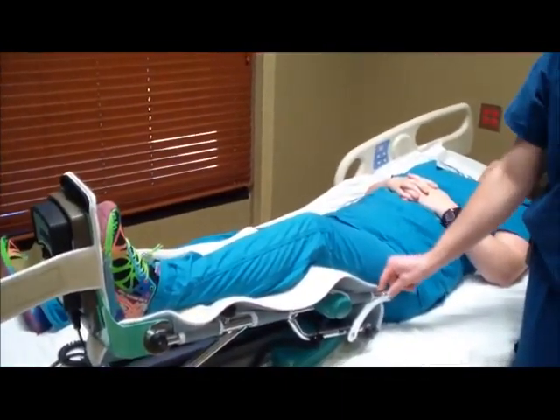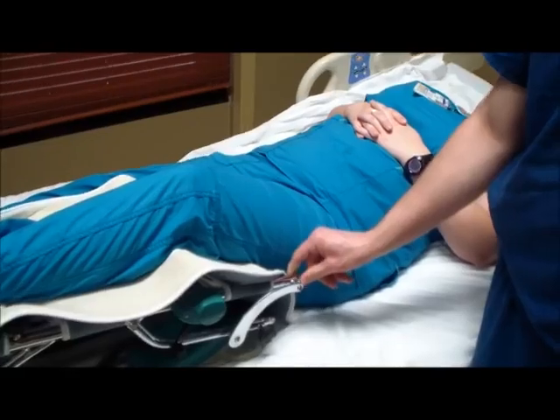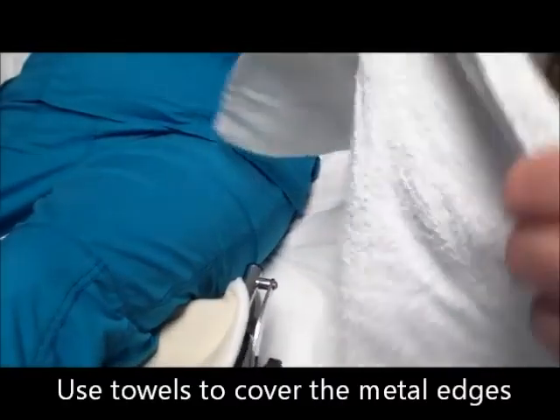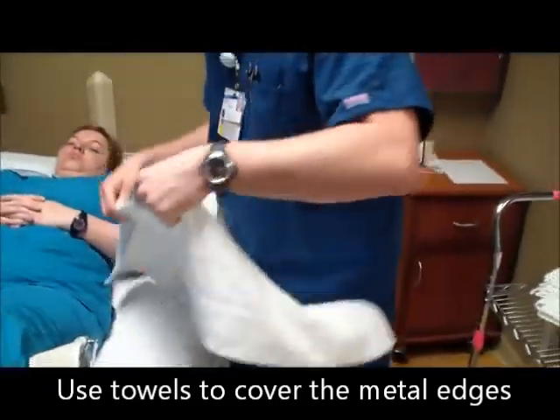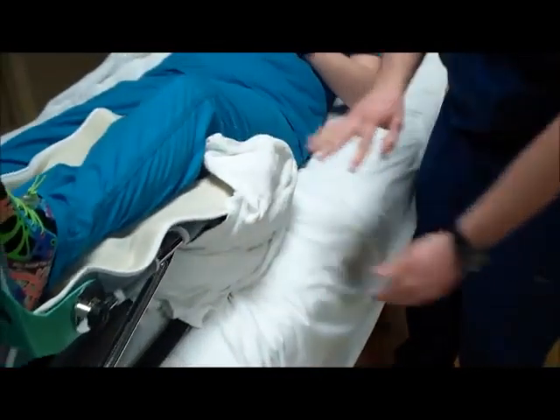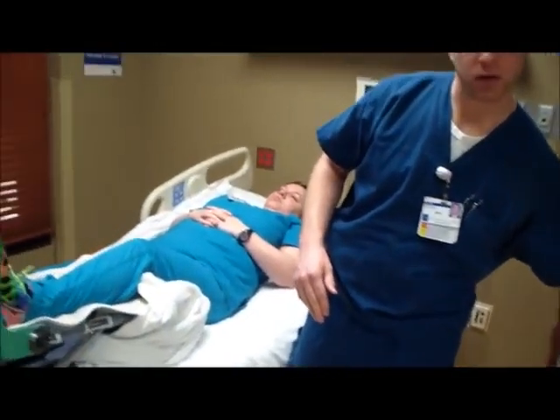On the top parts here, you have little metal bars that could cause skin breakdown. And this is where your towels are going to come into effect. You're going to unfold your towels, cover the top part here and bring them along on the inside. We're going to do the same thing on the inside part of the patient as well.